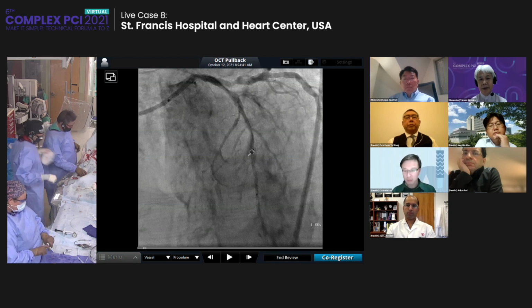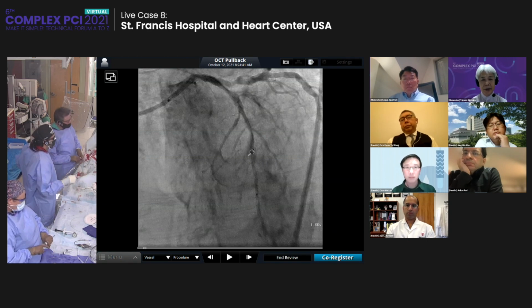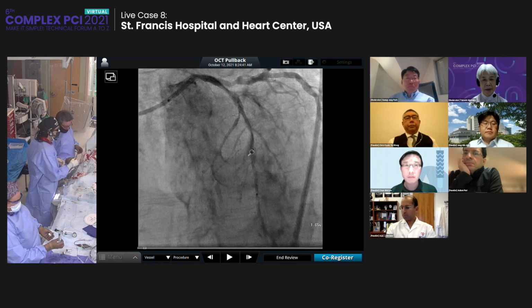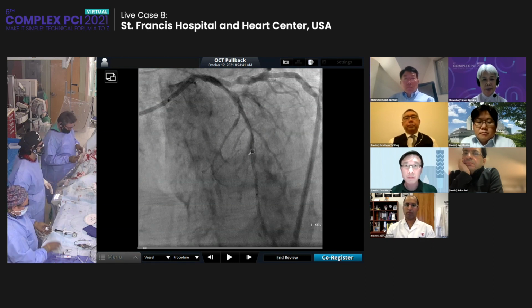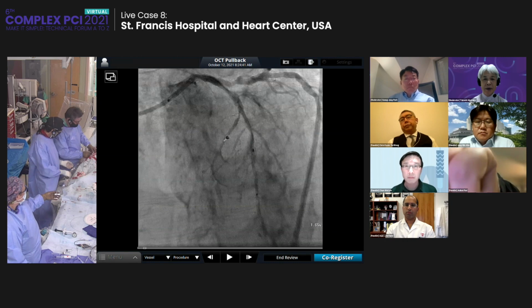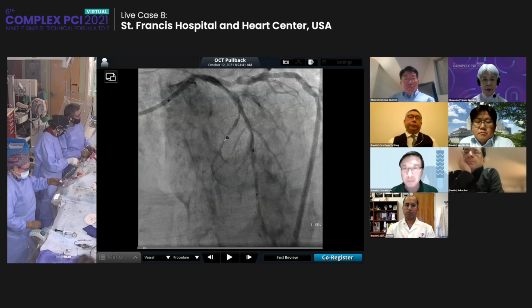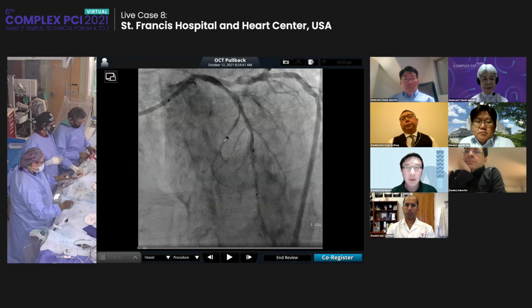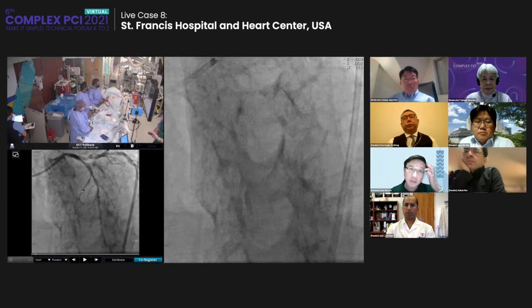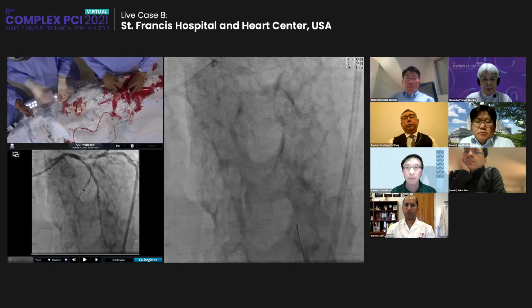Okay. So if you see, I don't know if you can see our OCT, Takashi, our distal marker, which is where the magnifying glass is. That's where we're going to land the stent. Yes. It's on the distal landing zone, right? Yes. Okay. So we extended our original 33 or 30 millimeter device to 38 because we injured the tissue in the proximal and distal segments.